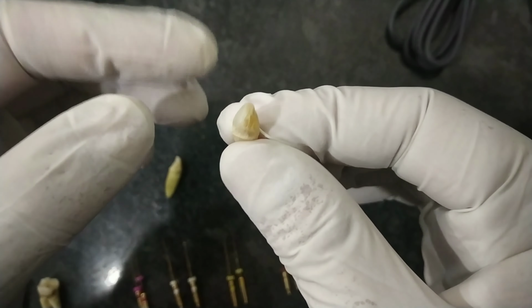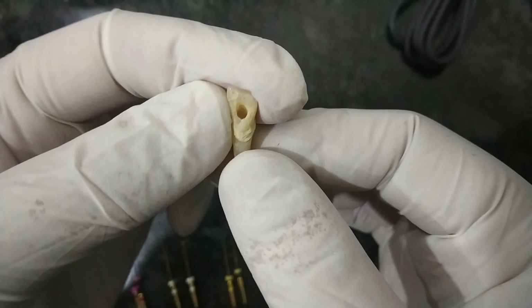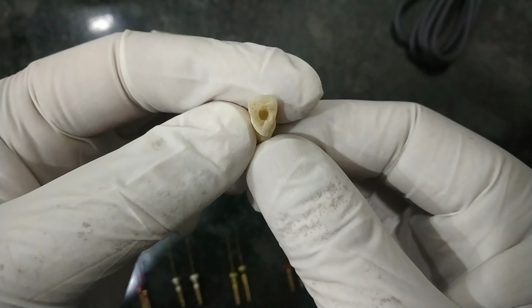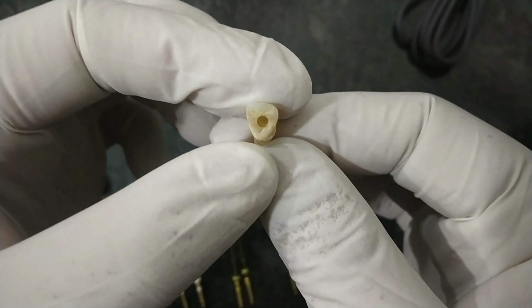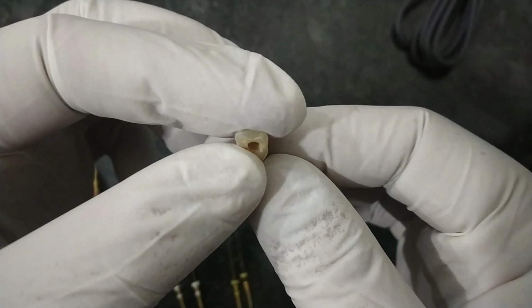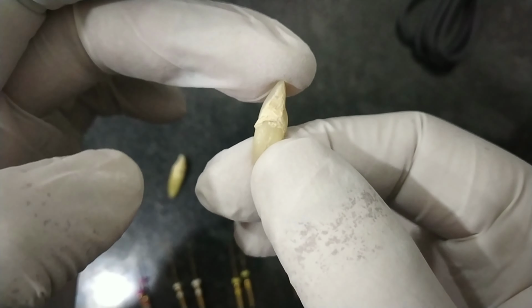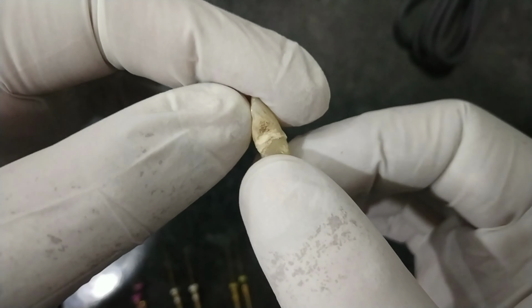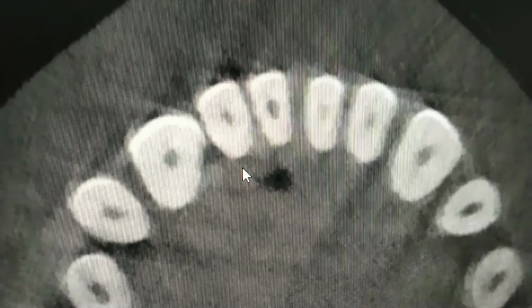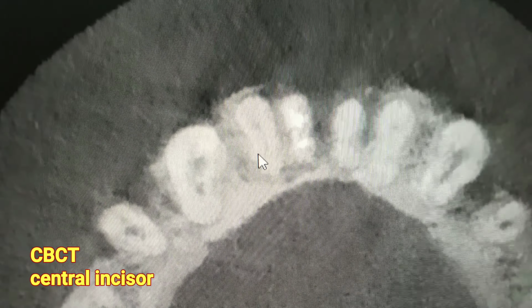Now we are coming to the lower anteriors. This is the lower central incisor, as you can see, and the root is quite straight. One important thing that you must know is that there is only one canal, but in a few cases, 30% of the cases, we get two canals in the mandibular central incisor. Now you can see the CBCT here. This is the lower central incisor, and we can see two canals here which are filled.